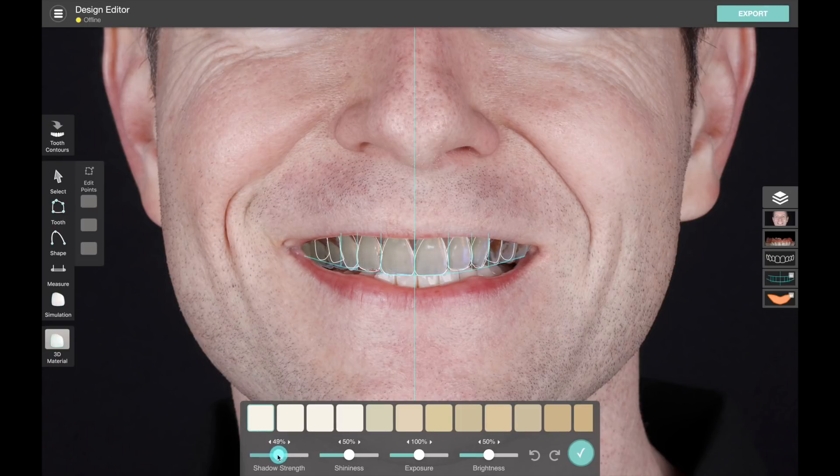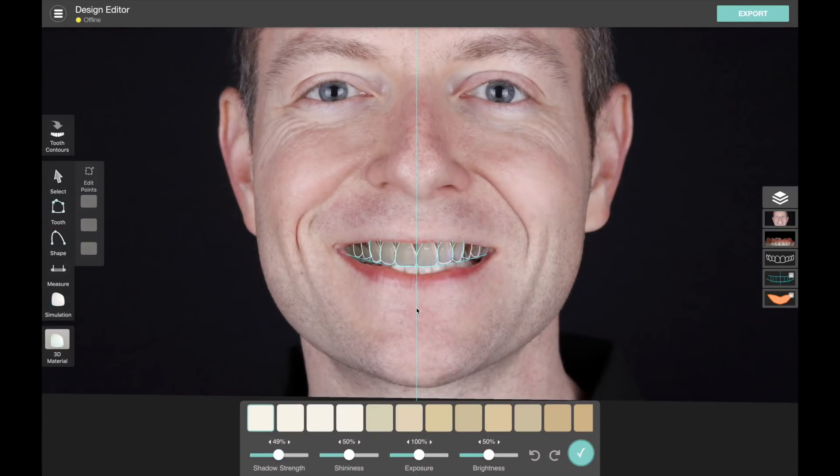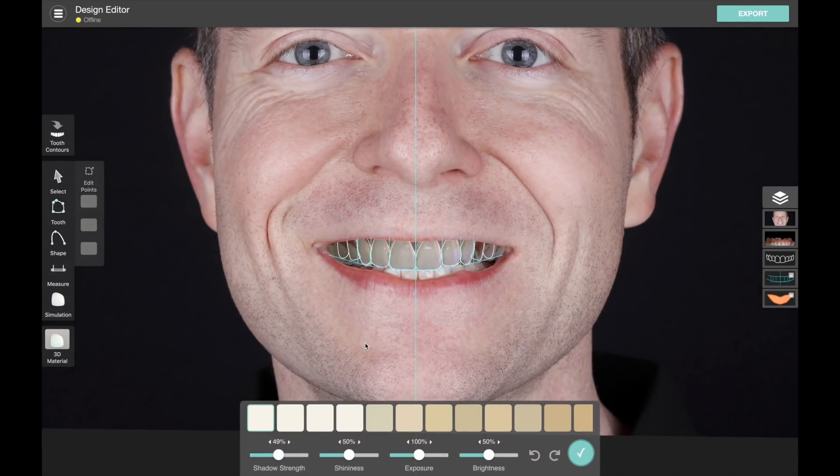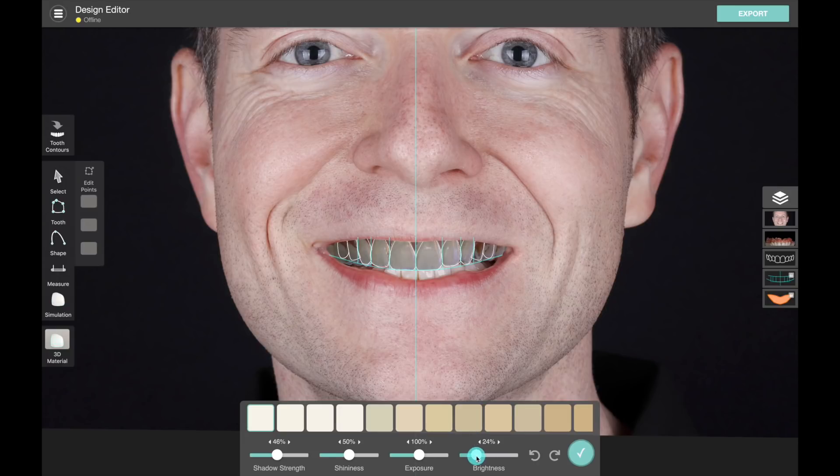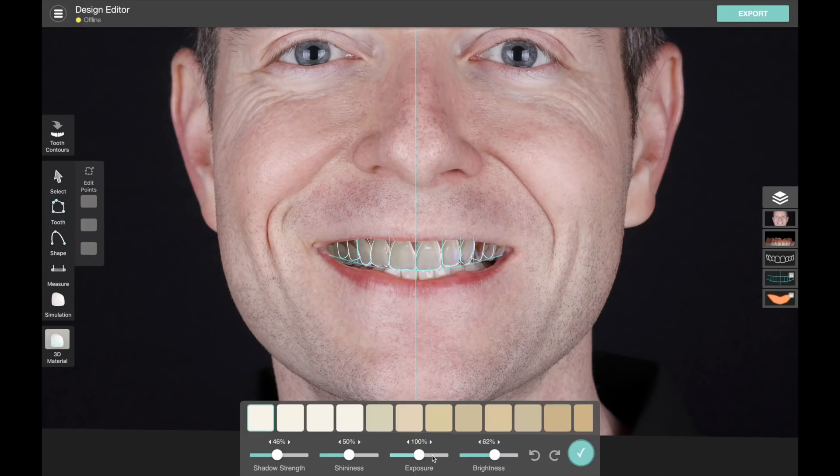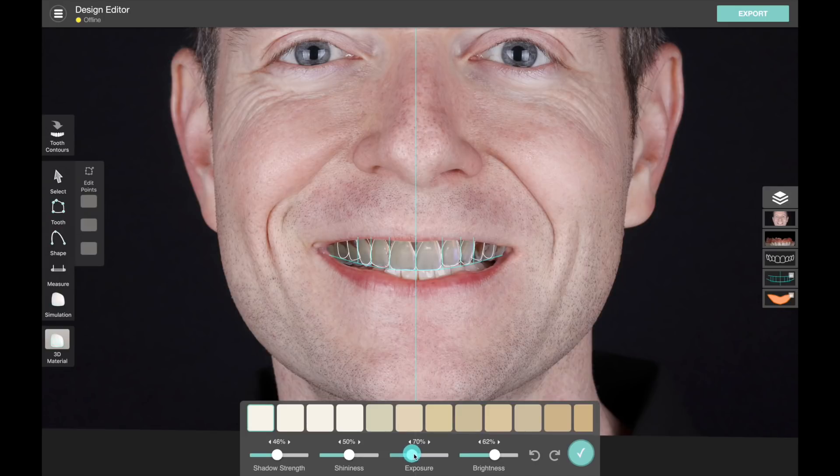The shadow effect helps the teeth blend into the picture a bit better. So you can simulate the shadowing as you recede in the mouth, and we also have exposure and brightness. Brightness affects the value of all the teeth uniformly, and exposure is exponential, so it's more like a photographic effect.